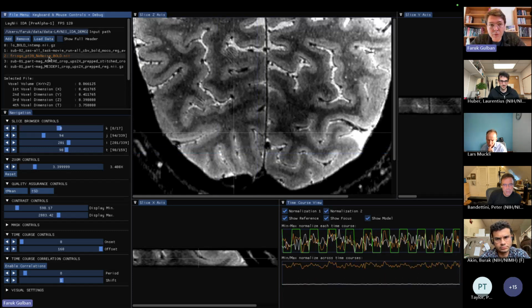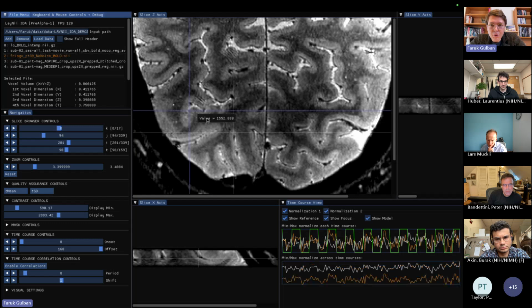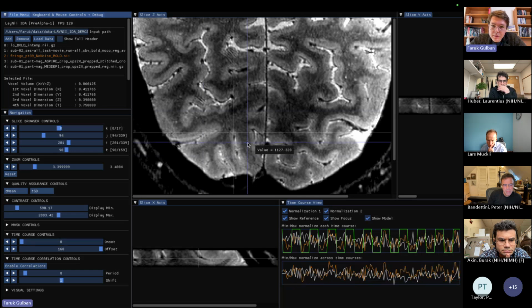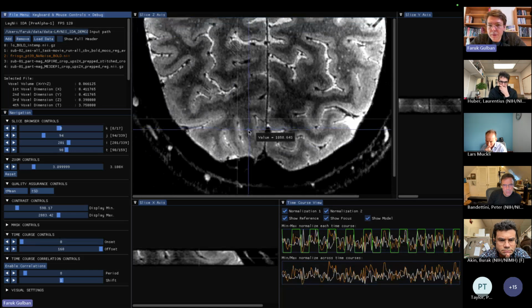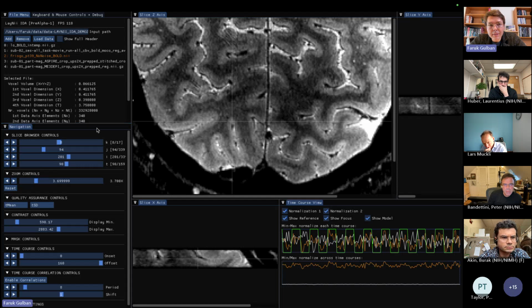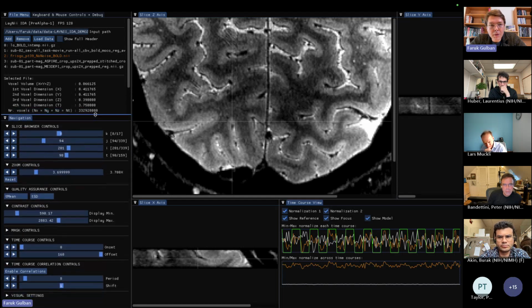And now it brings me to the last part that I wanted to show, because together with Renzo, and also Alessandra, we were looking at this quite a bit. This is the Frisco data from Renzo that is at 0.4 millimeter isotropic. This is the data that Renzo sent me, pre-processed by him. And there are like 300 million voxels in it.